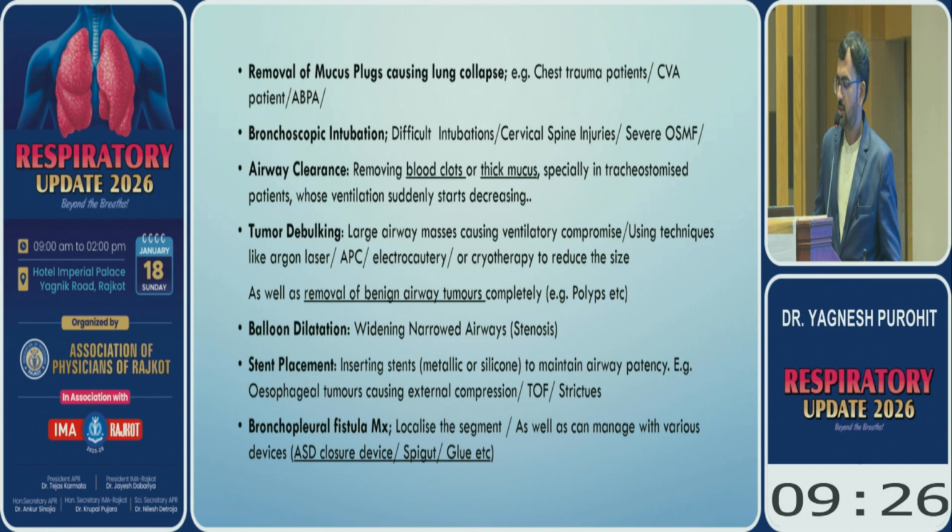Then in cases of lung collapse because of mucus plugs, especially in chest trauma patients or stroke patients, generally the respiratory movements become decreased. So many times the mucus secretions remain there and cause lung damage. So we can remove the mucus plug using the scope. Then in difficult intubations, especially in cervical spinal injuries or patients having severe submucous fibrosis, we can easily do the nasal bronchoscopic intubation.